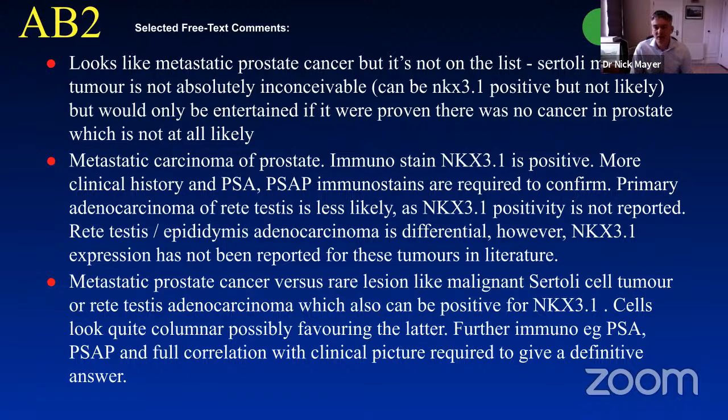there are reports of NKX3.1 being positive in some sex cord stromal tumors, some Sertoli cell tumors. So it's not 100% specific for prostate cancer. And a few other people also mentioned rete testis and epididymal adenocarcinoma as also being in the differential.